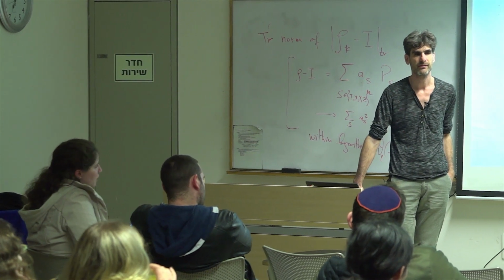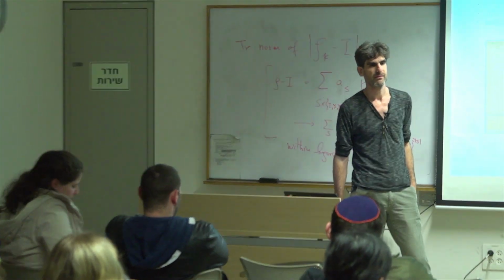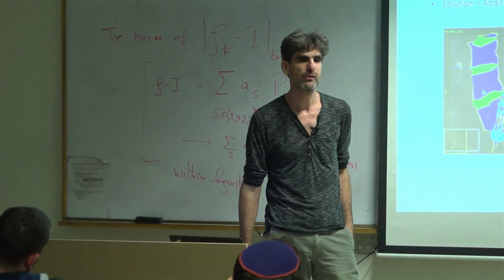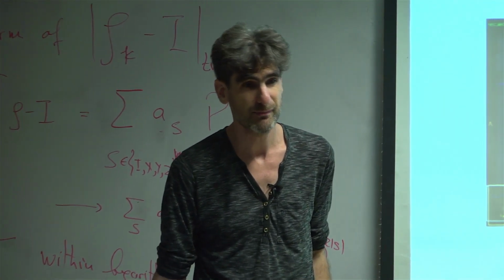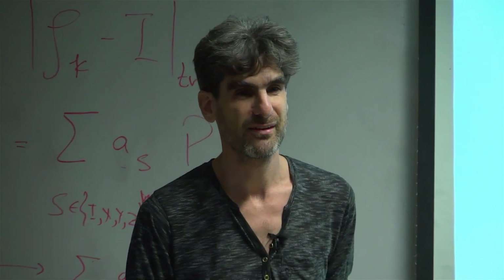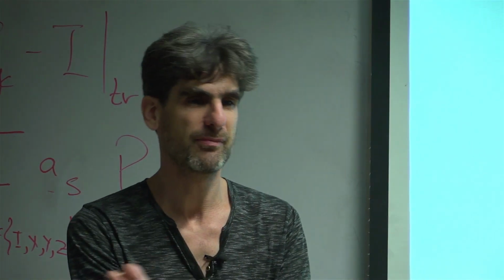Why is the metal detection an easier task because of the difference in? Yeah, even if you do a simple threshold, usually you could find it, but it's not really good enough. You find like a piece and a piece and a piece, but you can see it even visually much more clearly than the bone, just because it's a denser material.